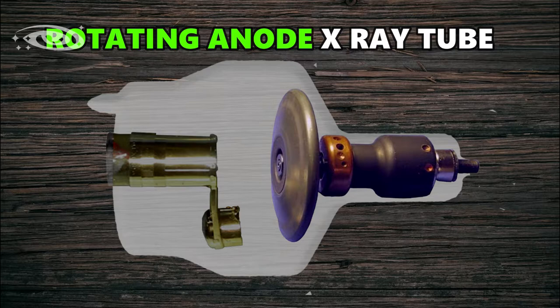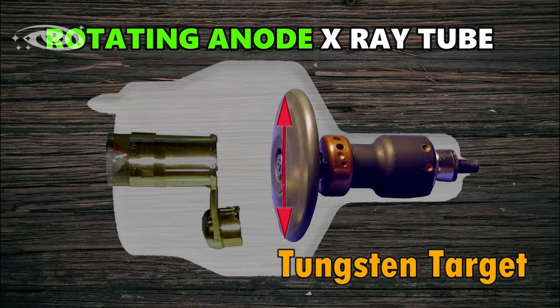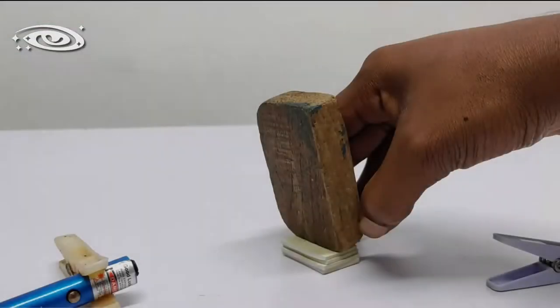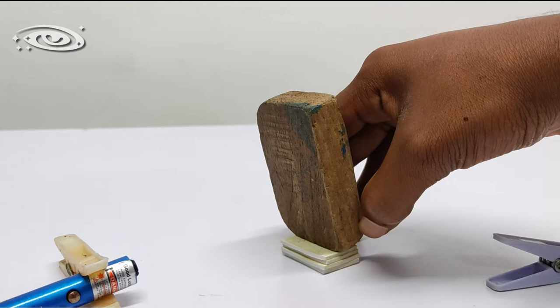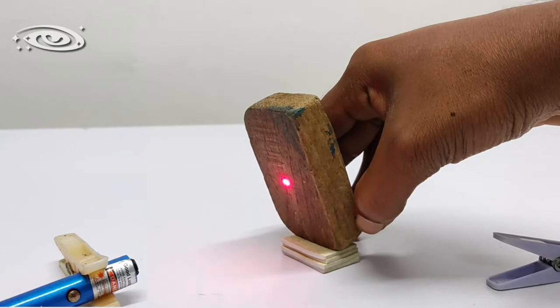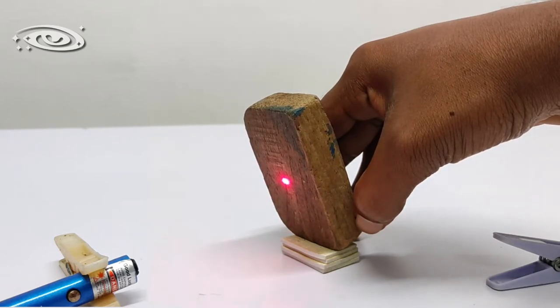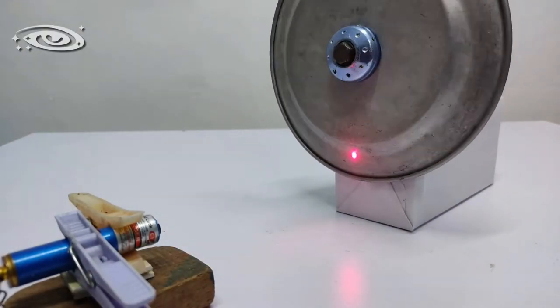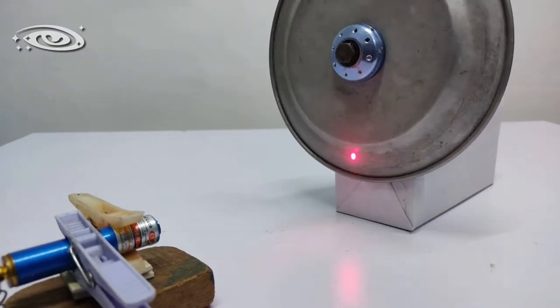In rotating anode X-ray tube, the target is not stationary and also target is not very small. The target is large. It is large disk function target. And they made this target disk to rotate by using rotor. In previous generation X-ray tubes target is stationary. So all the electrons will interact at the same region for each and every exposure. And also only small region is used to produce X-rays. So by rotating the target, we can use all the region of this X-ray tube and it can also reduce the pitting.